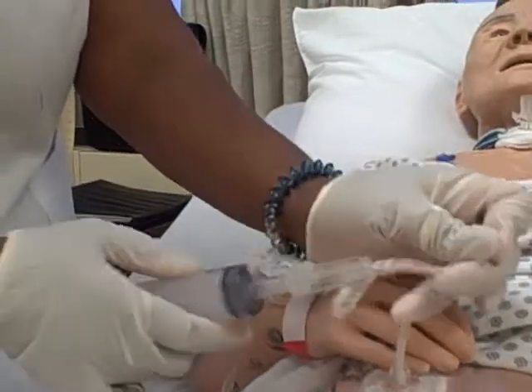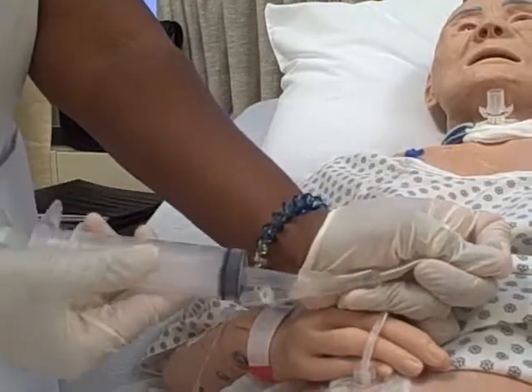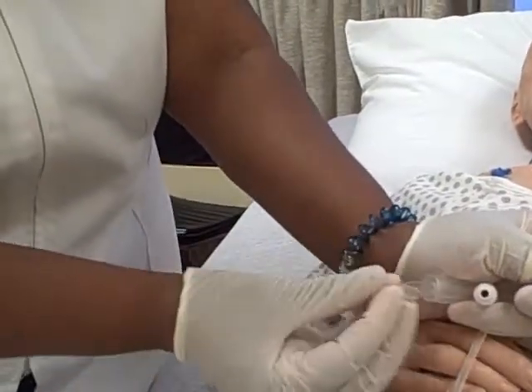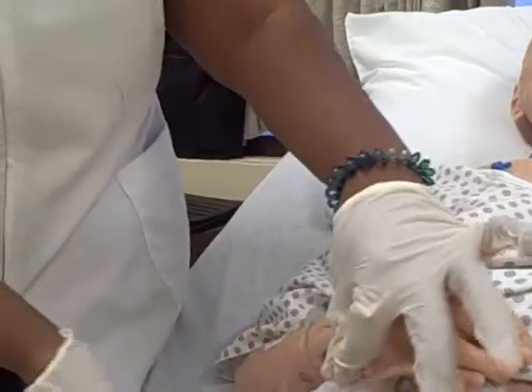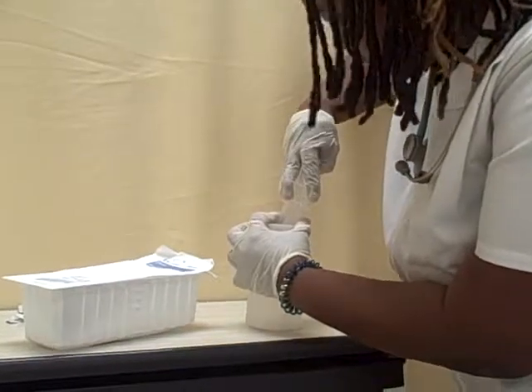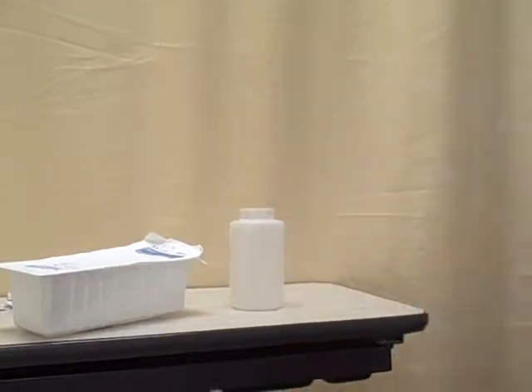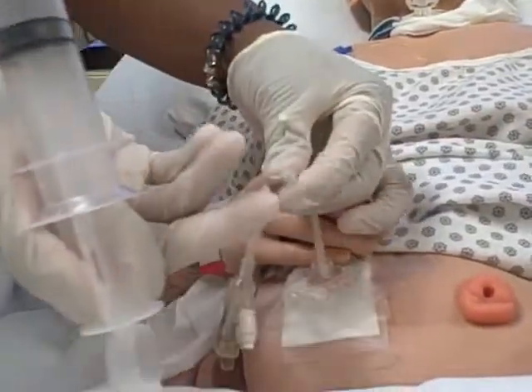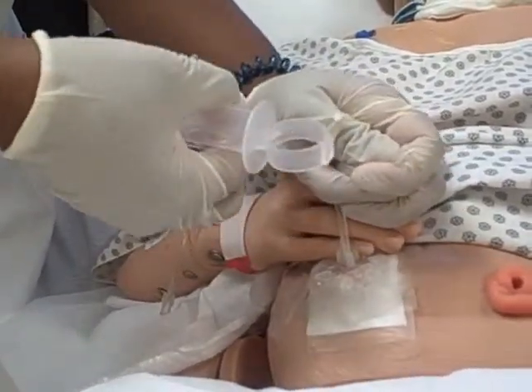I'm going to kink the tube. I'm going to put the cap on. Then I want to pull out 30 cc's of tap water. Going to kink the tube once more. Going to uncap.